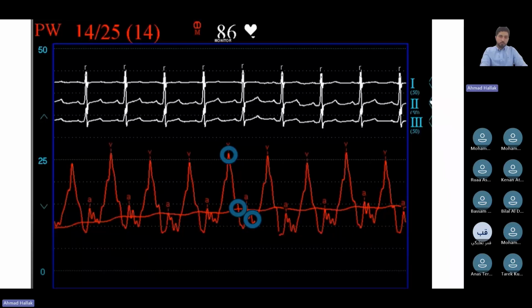So keep that in mind when you're doing the wedge pressure and you have very high V waves. Normally the mean and the end diastolic pressure are almost the same, but because you have very high V waves, you're going to notice that the wedge pressure gets higher. So it's really only in these situations that the wedge pressure is considerably different than the end diastolic pressure.